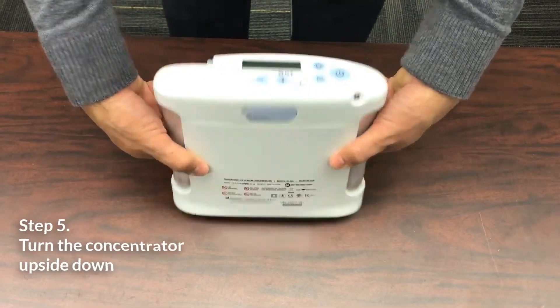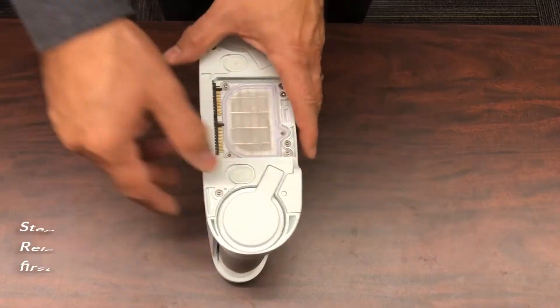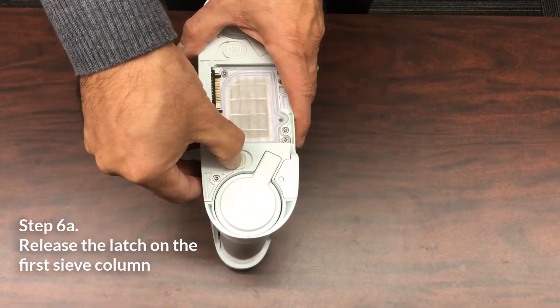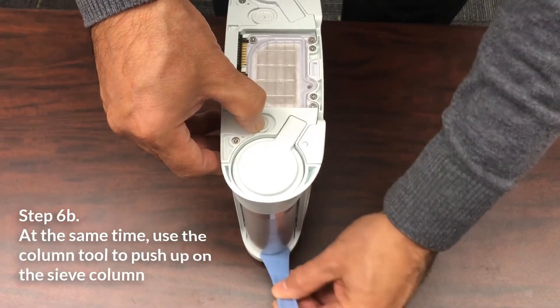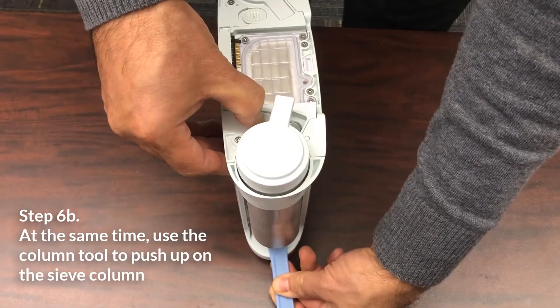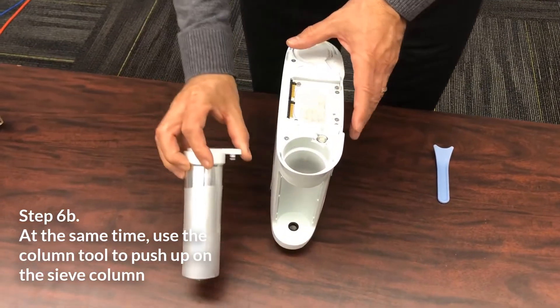Turn the concentrator over so it is standing in the upside down position. Remove the first column by pressing down on the latch button with your thumb or finger. Simultaneously, insert the column tool underneath the opposite side of the column with your other hand. Remove the column completely from the concentrator.